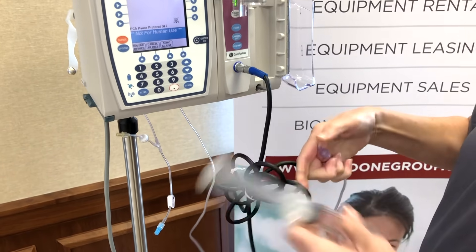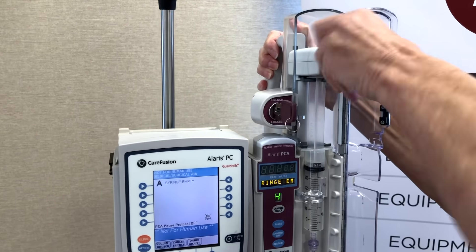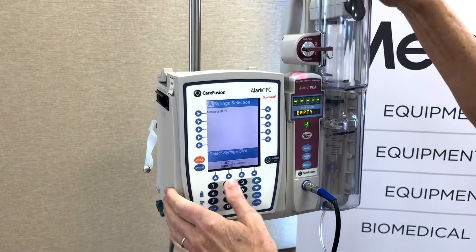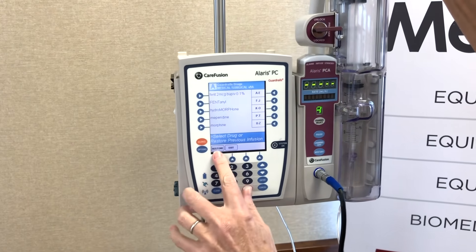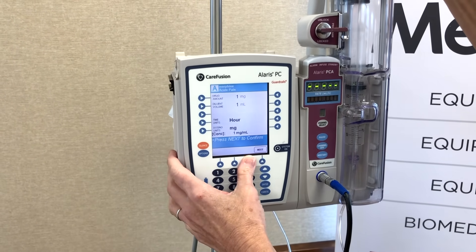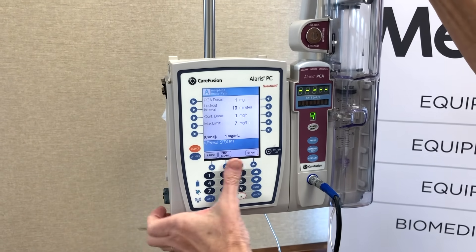Coming back with the same volume, the same drug, the same parameters — you're going to reload your syringe using the three steps, then close and lock the door. Hit channel select, turn your key to program, and look for your syringe. Confirm your syringe size, and notice this restore button. If everything is the same and you're swapping out for the exact same syringe as the one prior, press restore and all those parameters will populate for you so you don't have to re-enter everything. It will pre-populate the same settings and you're ready to press start.